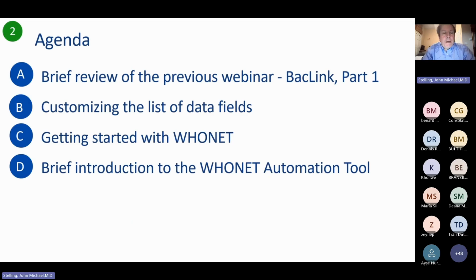So we'll cover 4 topics today. A brief review of the previous webinar, especially for people who were not able to join the last time. Customizing the list of data fields. Getting started with WHONET, and then a brief introduction to the WHONET Automation Tool. We won't spend a lot of time on it, but we do plan to have a full webinar on the WHONET Automation Tool, either for the next webinar or for the one after that.